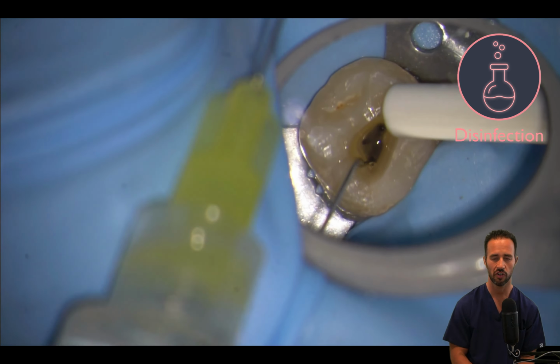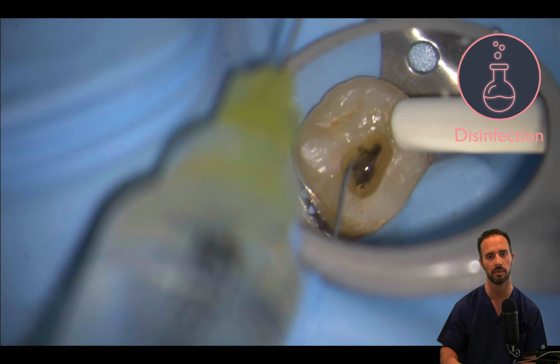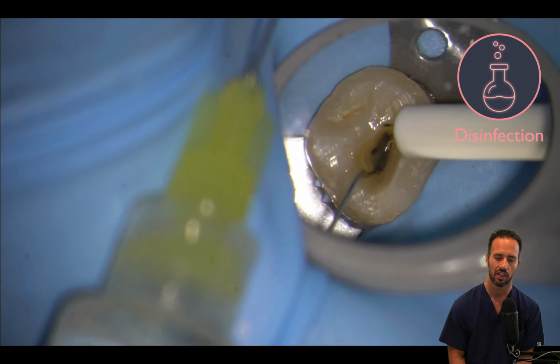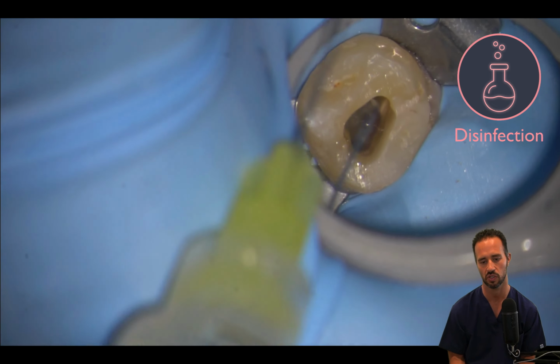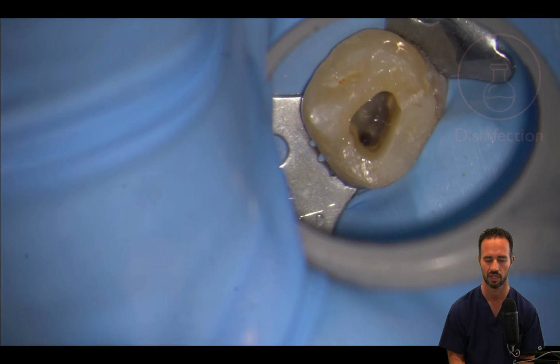Remember, during that search for the MB2, the sodium hypochlorite had a chance to soak in the 3 main canals for a pretty significant amount of time. So, use that to your advantage. You're going to be using that time anyway to look for an MB2. You might as well let the sodium hypochlorite soak in the other canals just to increase your level of disinfection.